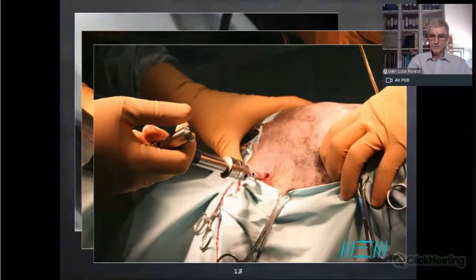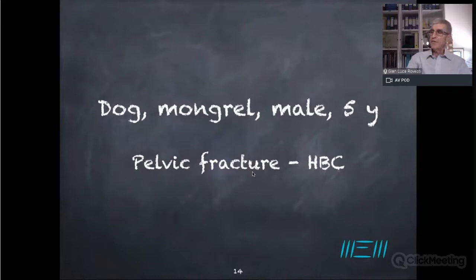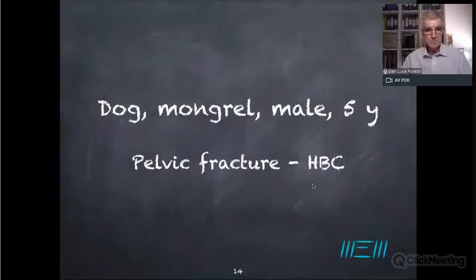Okay, just the first example of a case, a small dog hit by a car, as you see, and I think it's a common experience that most of the dogs or cats have high energy traumas, because in order to fracture the pelvis, a high level of energy is required. So we have this kind of situation.